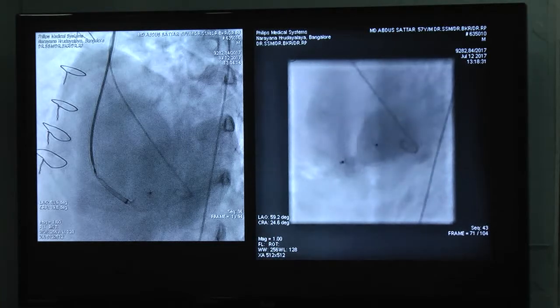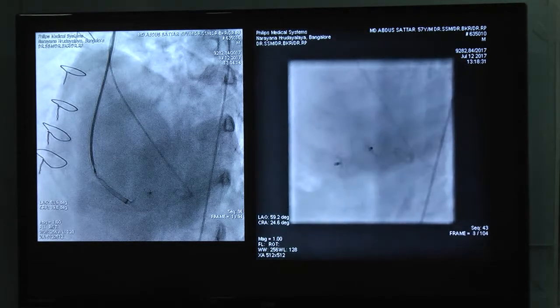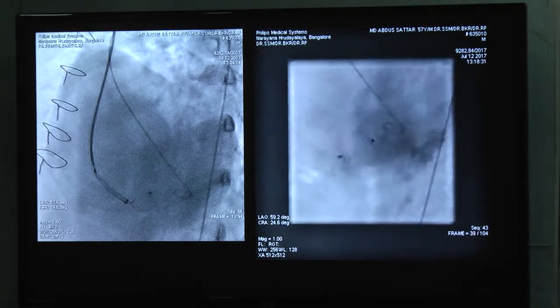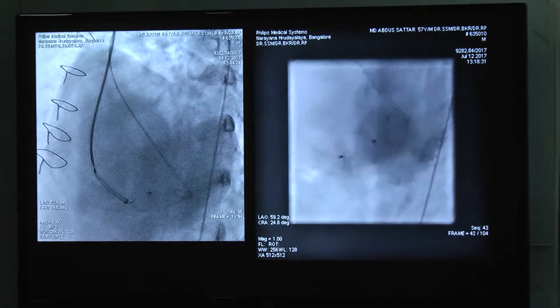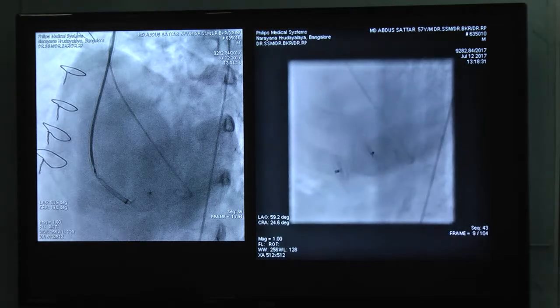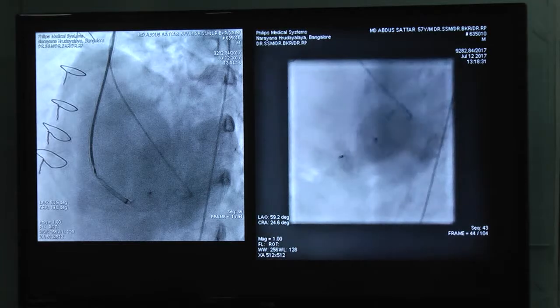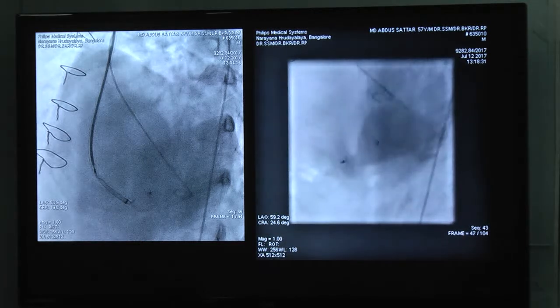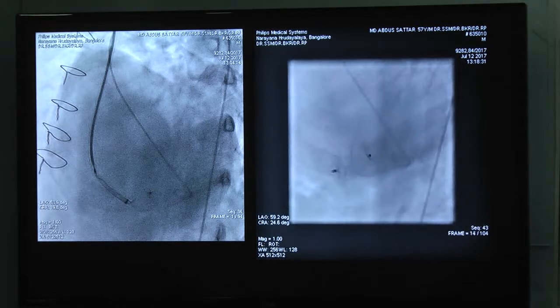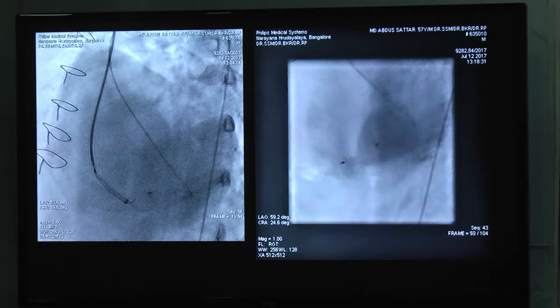So that on table, they will have pulmonary hypertension. Post-infarction patient. They are in pulmonary edema, they have pulmonary hypertension, very difficult cases because they'll not be able to lie down for you for a longer time. So we approach through the neck. So everything should be ready, you put the TE probe, and you should finish your case within half an hour, 45 minutes. But quite satisfying because the PA pressure falls on the table drastically to 1/3 or near normal. And the patient in the next 2 days will come and tell you, real thanks, because there was no other procedures for them otherwise.